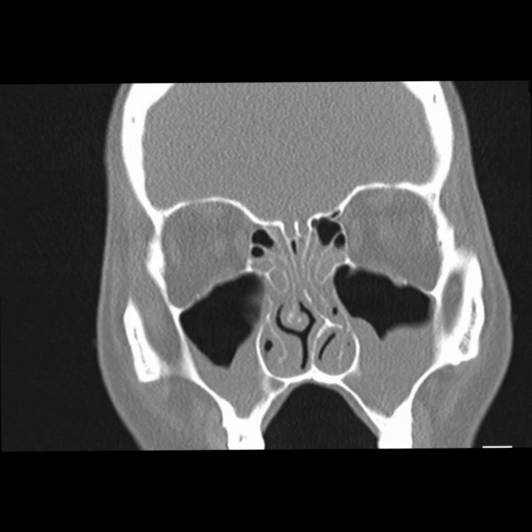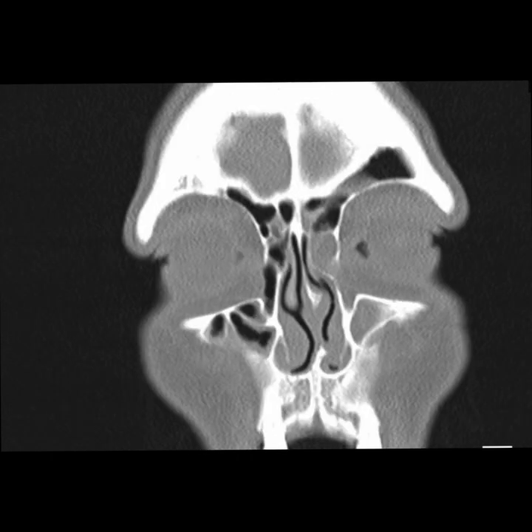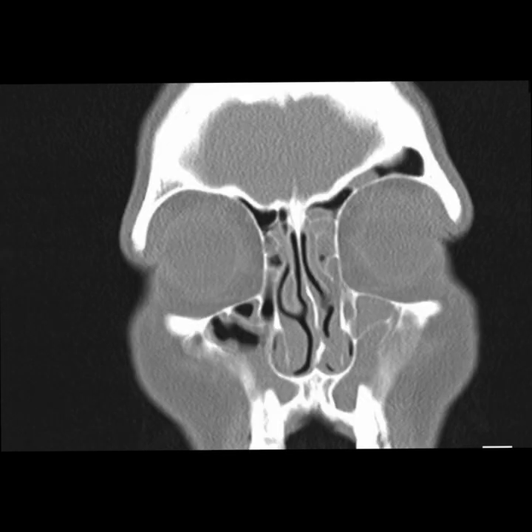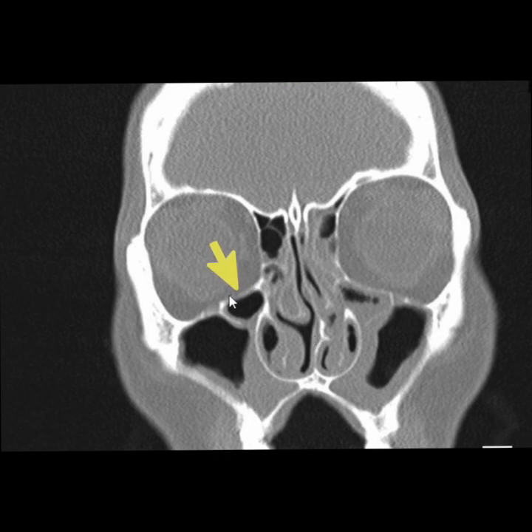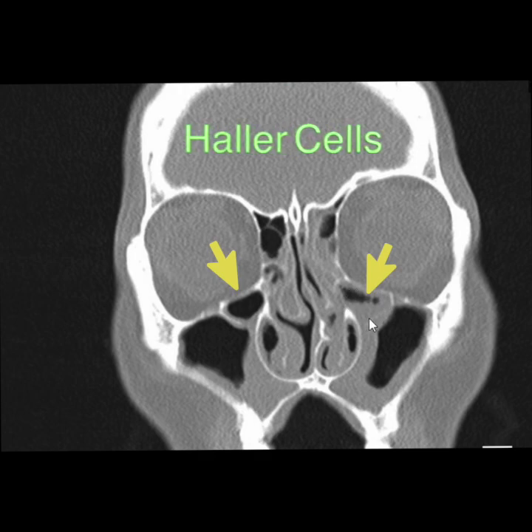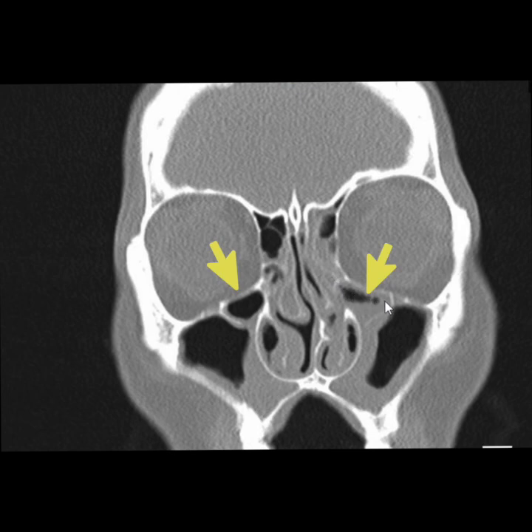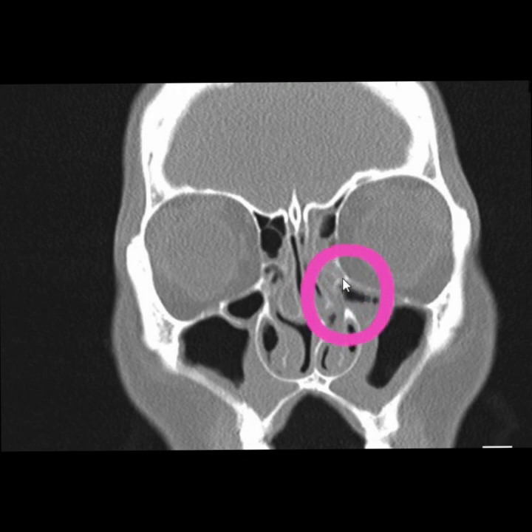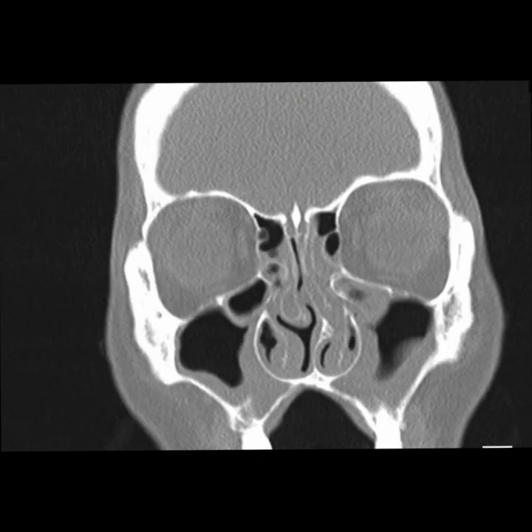Moving on to the next finding: as you would have already noticed while I was scrolling the scan, it's not only this deviated septum I want to show you. There are bilateral Haller cells. What is a Haller cell? A Haller cell is an ethmoidal cell which has migrated laterally and gone onto the roof of the maxillary sinus. It has gone laterally and situated there — if this increases, you can obviously understand it can occlude the ostiomeatal complex and cause sinusitis. This is why this is a really interesting scan — there are so many anatomical variations that can occlude the sinuses.